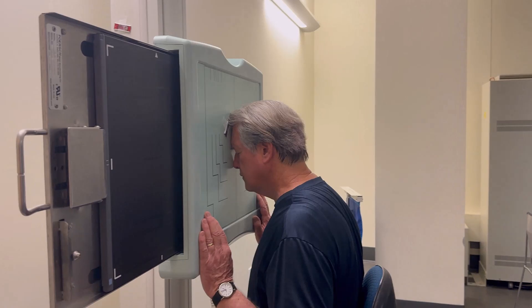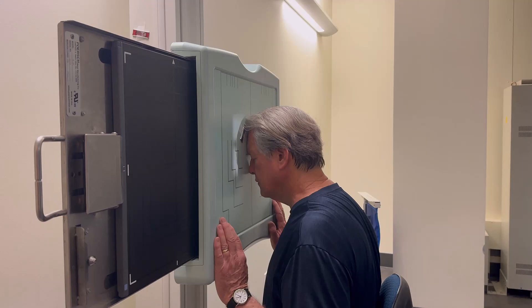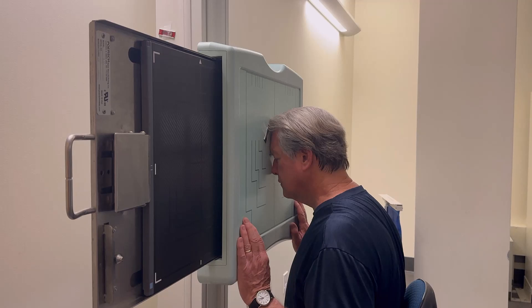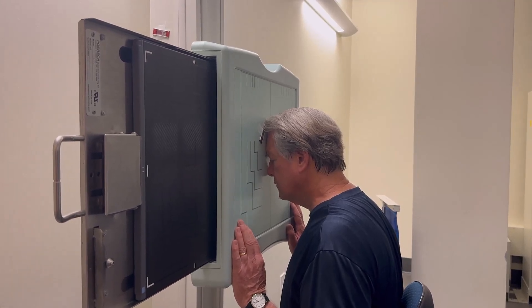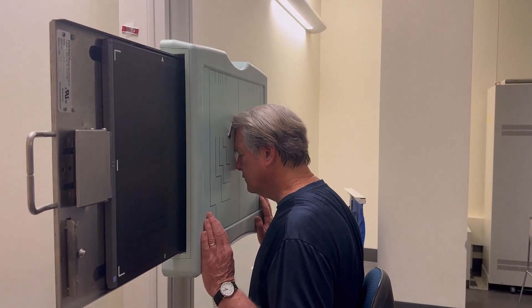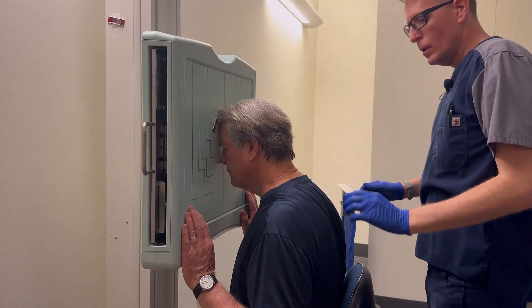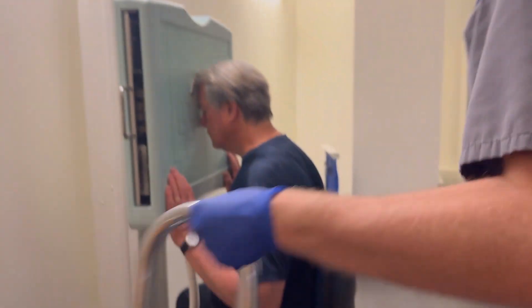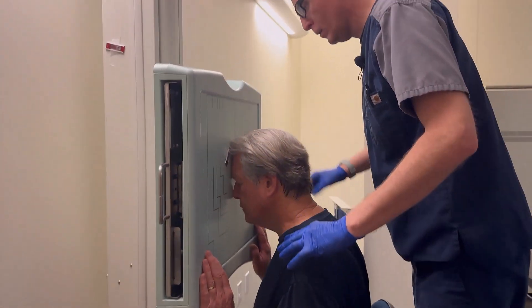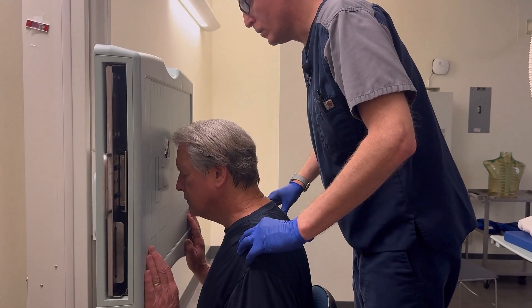Just want to make sure I'm lined up — to the notch on the IR rather than the line on the bucky itself. I want to get some height and make sure I don't have tilt or rotation, so I'm going to look down from overhead. I'm going to pull you back slightly, shift you over, and then just rest there.